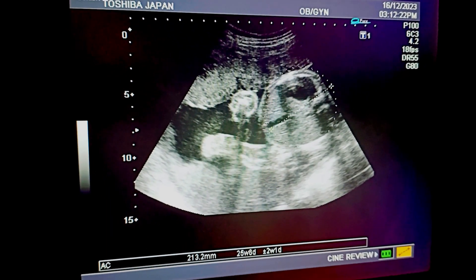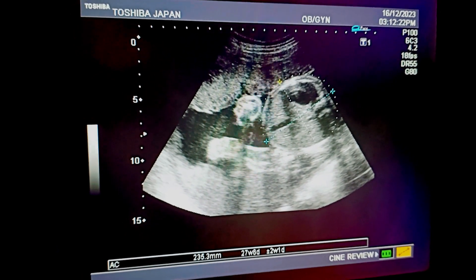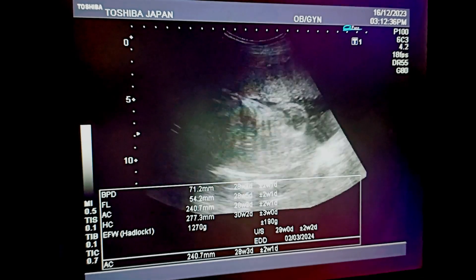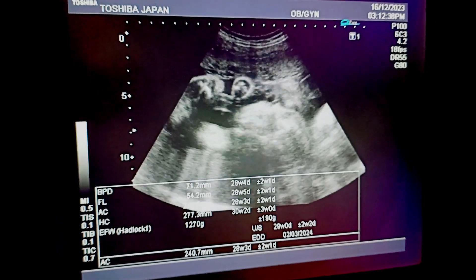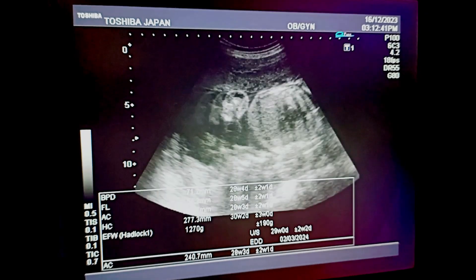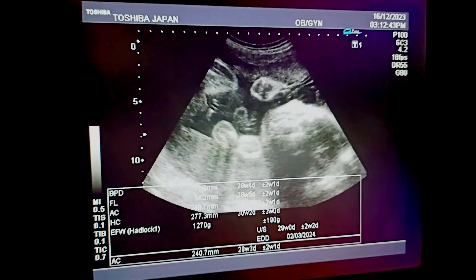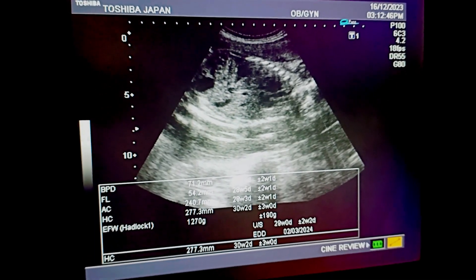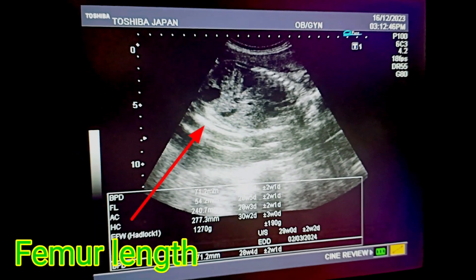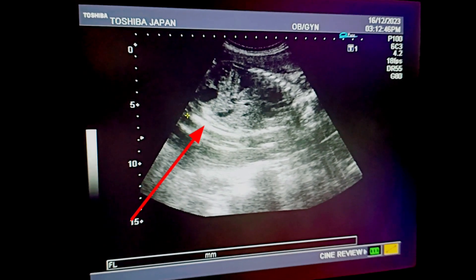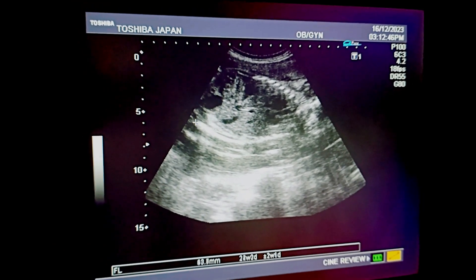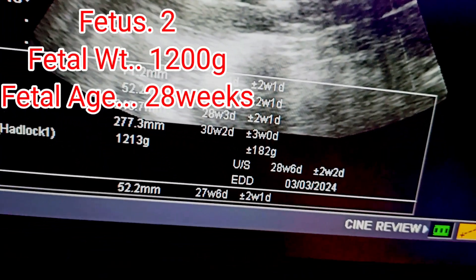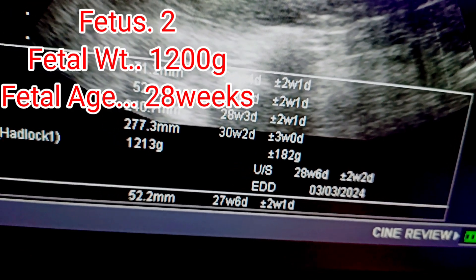The fetal weight of fetus two appears to be approximately 1200 grams and the fetal age appears to be 28 weeks of pregnancy. Here you can see the femur length. The placenta is bilobed — you can see the different parameters of fetus two.